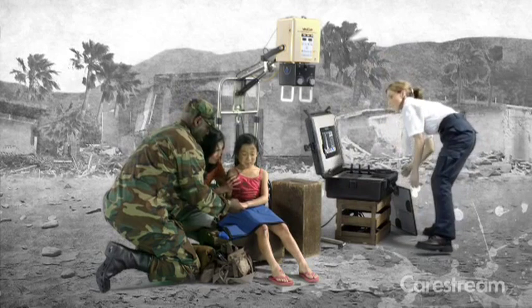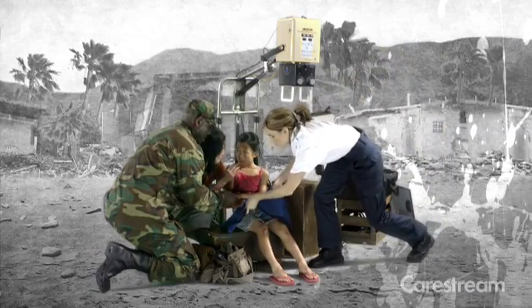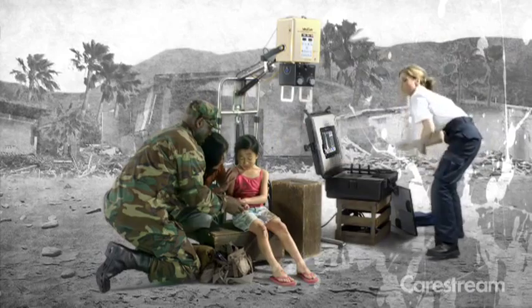The detector and image processing software produces extremely high-quality images, without inputting body part or projection. Now you're ready for your next patient.